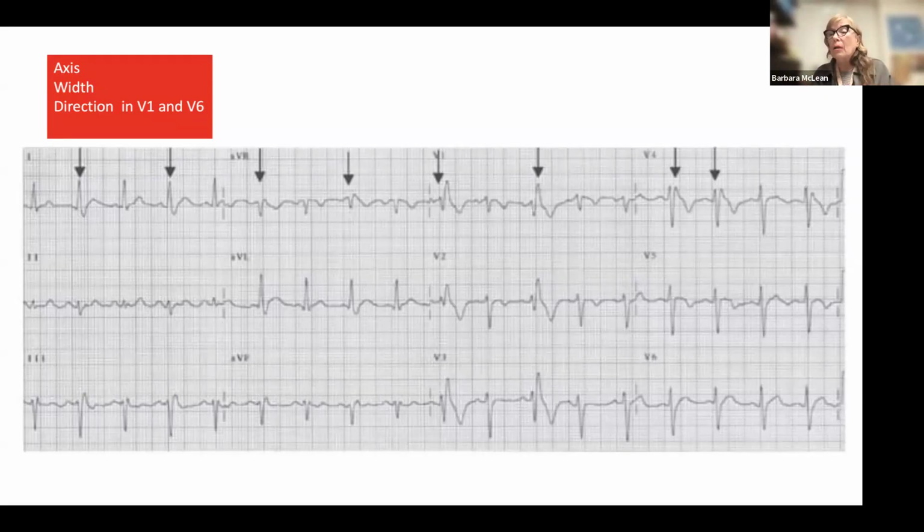And what's going to be wrong here is either you have an old MI or you have a right bundle branch block with a left anterior fascicular block. So I'm a little ahead of myself. I'm so sorry because I would never want to do that, but we'll come back to this a little later. With our right bundle branch block, that fourth clue, when I see that right bundle branch block, I expect to see the ST segment sloping downwards and the T wave in the opposite direction. So this is called discordance. And I expect discordance whenever I have a right bundle branch block.